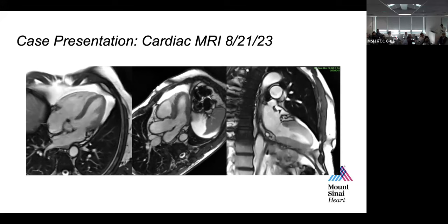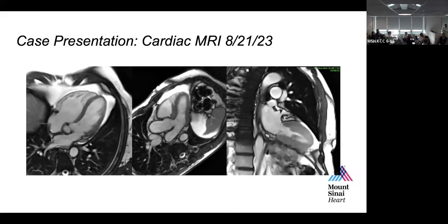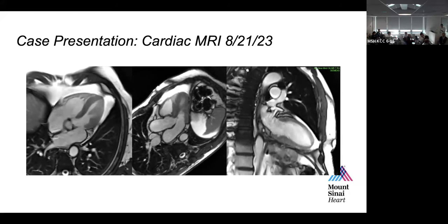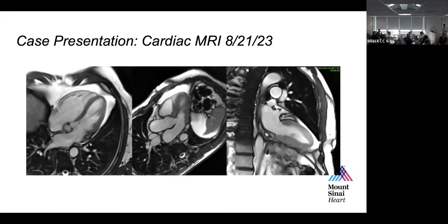And then looking at the tricuspid and mitral valve, interestingly enough, the echo reported mild TR, mild MR. Usually on the MRI, we would not say qualitatively mild or qualitatively moderate unless we can calculate a degree of regurgitation. We would say there's a systolic dephasing jet of TR or MR, because we can't use the width of the jet or the characteristics of the jet on MRI to describe or to quantify the degree of regurgitation.